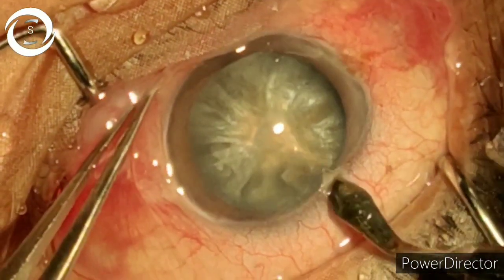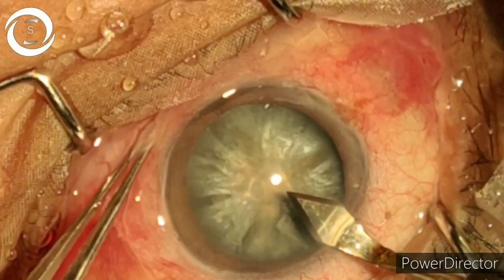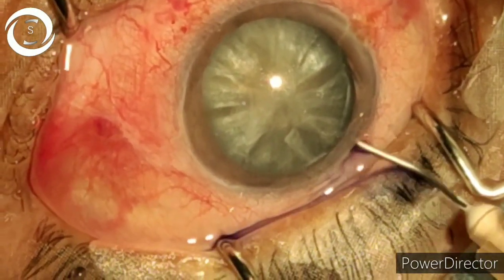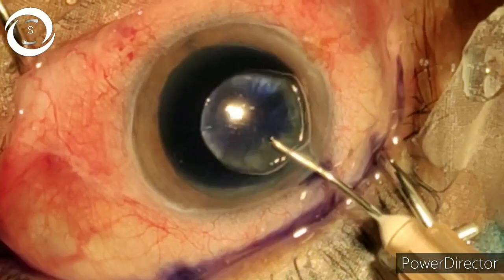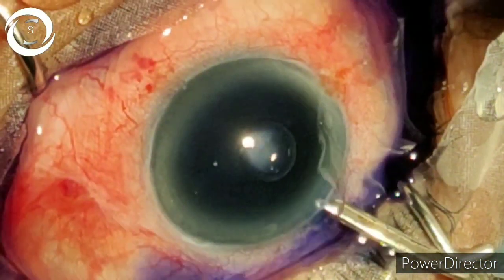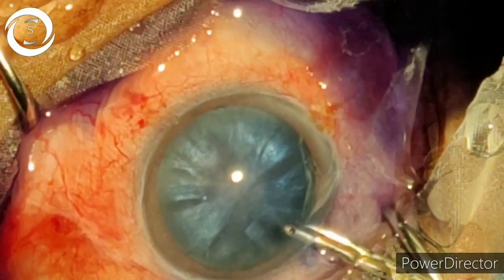The first step is a two-step incision — it should be well controlled, and it will make the following steps go smoothly. Now we are staining the anterior capsule with a blue dye, and the anterior capsule has been stained.